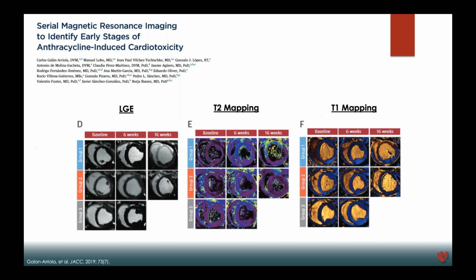And do most MRI machines have that capacity, or is it only if you have specific software? So all MRIs definitely have the capacity to check for T2 weighted sequences, because most cardiac MRIs are going to be checking for T2 STIR, but it's dependent on the vendor getting the software you need to do the T2 and T1 color maps. That is an extra thing you have to get from your vendor. But all cardiac MRI centers can do T2 STIR imaging, at least, where you can get a qualitative assessment of the presence of edema. You may have to do some extra post-processing with specific software to get the T2 color map.